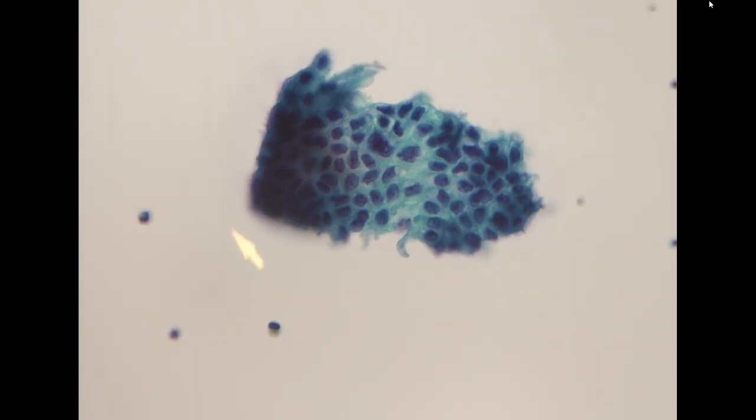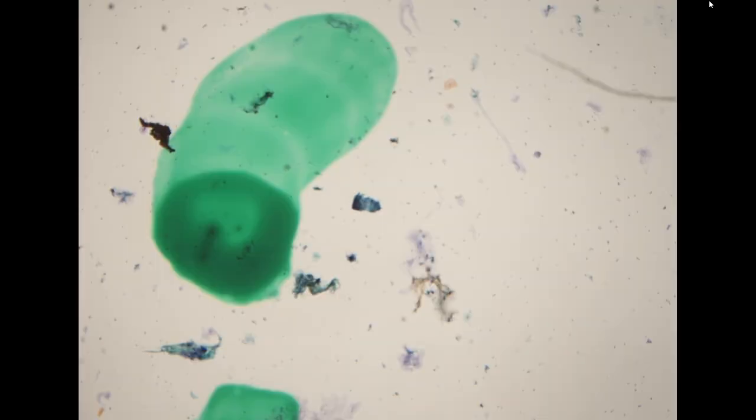We call this drunken honeycombing, because the distance between nuclei varies: some are very close, even overlapping, some are very far apart, with very irregular spaces between them. This is also a sign suggesting a well-differentiated adenocarcinoma. So this is relatively challenging, but we can still have a very high suspicion that this is adenocarcinoma.